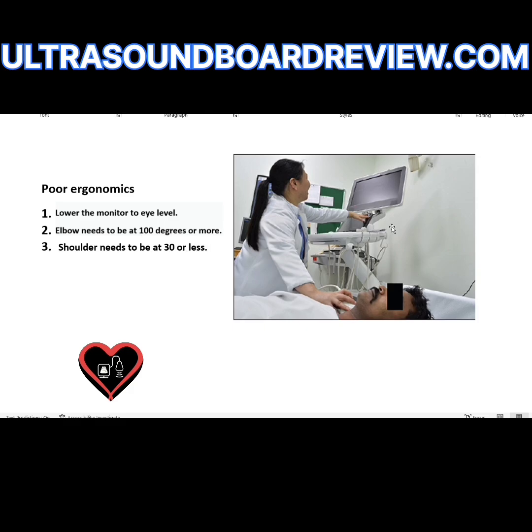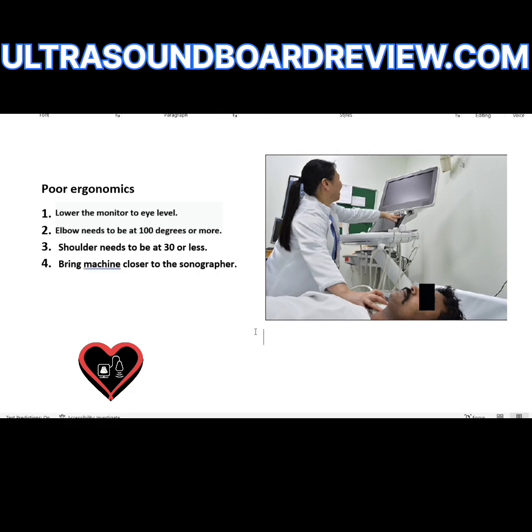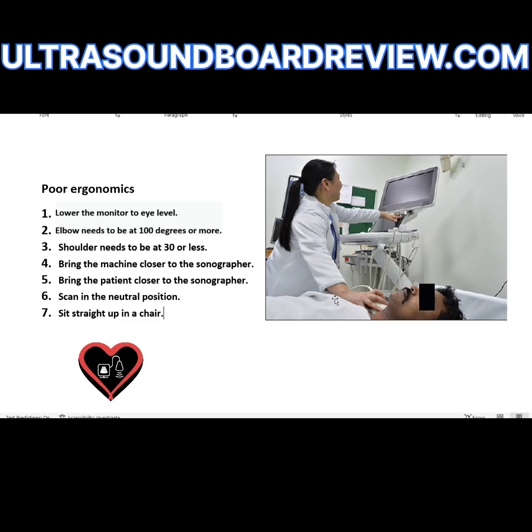Do you see how she's extending her arm to touch that button? She needs to bring the machine closer to her, or move her and the patient closer to the machine. She needs to be close to the patient — bring the patient closer to the sonographer. She needs to scan in the neutral position, and she needs to sit straight up in a chair. If she decides to keep standing, she needs to raise the patient up and bring the monitor to eye level.